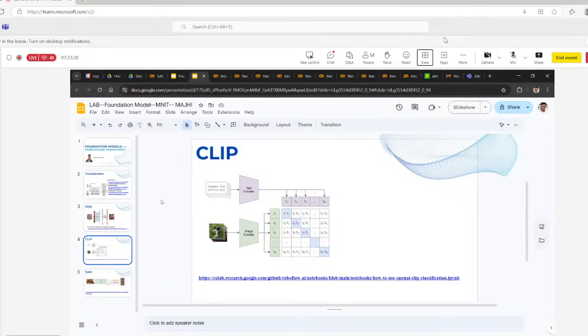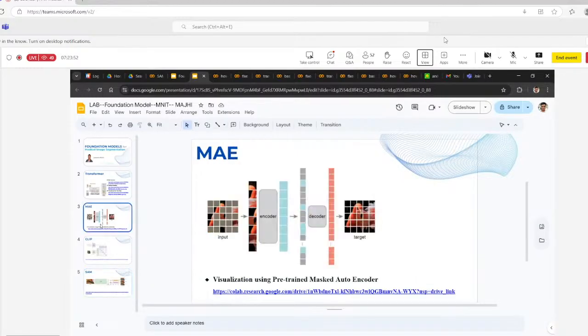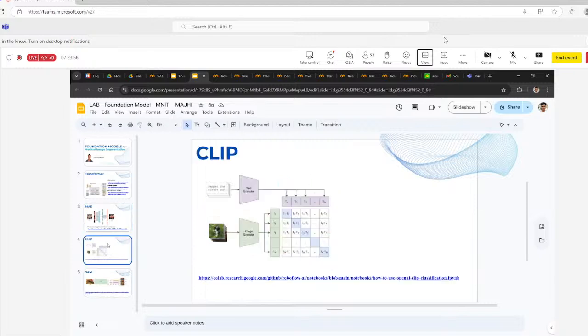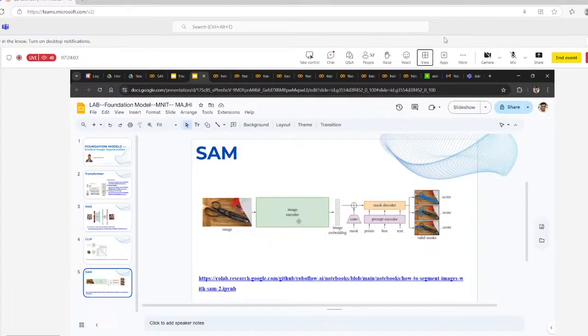Okay, so then I think for the segmentation, one of the major parts is the SAM model. If I have to quickly recap the SAM model: across all these three foundation models, the encoder is always the backbone. So the image encoder is the backbone in CLIP, and similarly in SAM as well, the image encoder is the backbone, right?